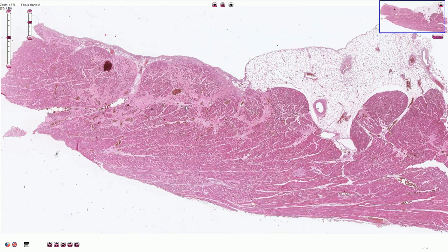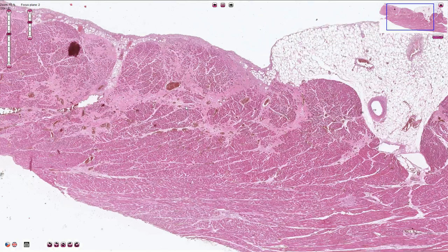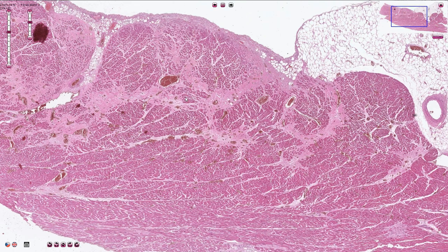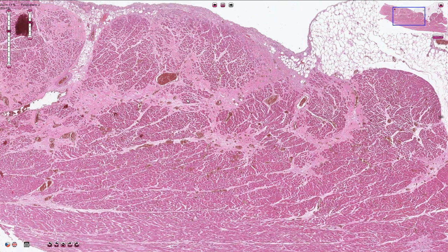Fibrous tissue is produced by fibroblasts, and fiber production can be part of the healing process and scar tissue formation after myocardial injury, for example after myocardial infarction. However, the fibrosis after myocardial infarction is usually more prominent and confluent.